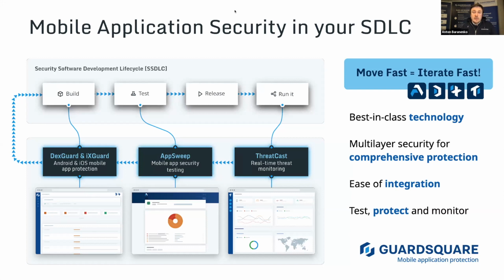So I would say that for a medical device, this is an absolutely mandatory practice to do. But something to keep in mind is that penetration testing, which is done manually, delivers you a high quality result, but it requires time to perform. So the feedback loop is rather long.